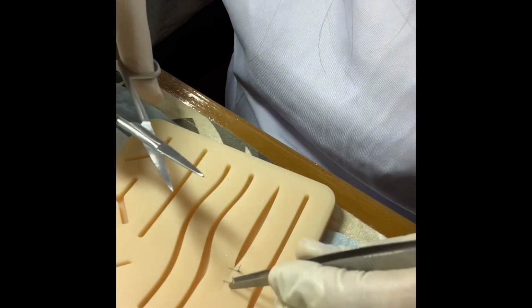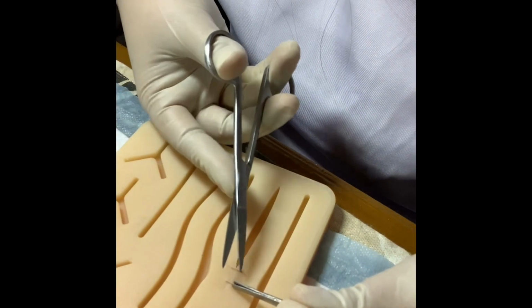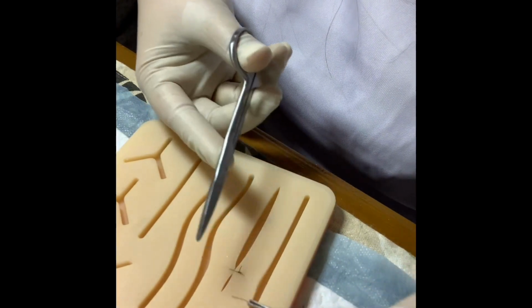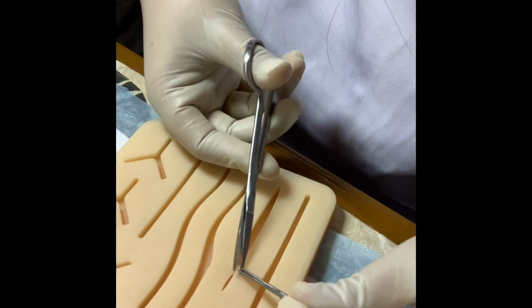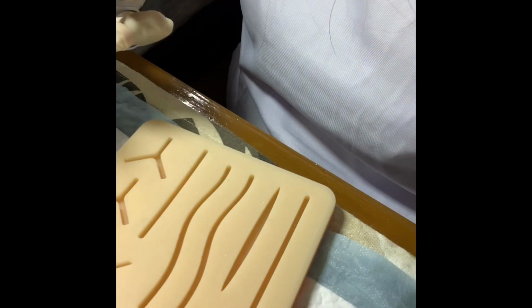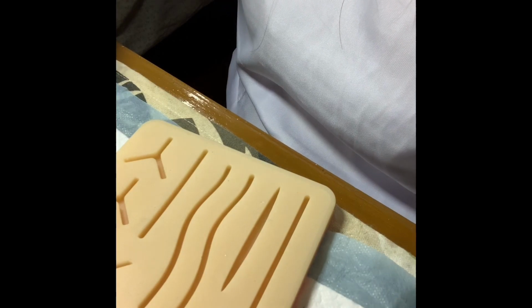To remove the suture, get the forceps and slightly pull the suture up and cut at the knot side to avoid infections. The wound should be washed and dried, then dressed appropriately. For removing suture, the average time frame is 7 to 10 days after the suture. For the face, 4 to 5 days, body and scalp, 7 days.